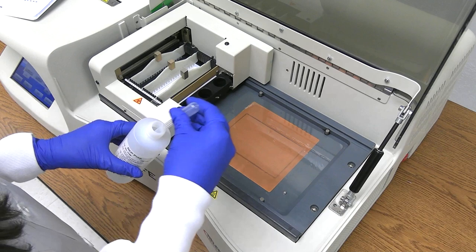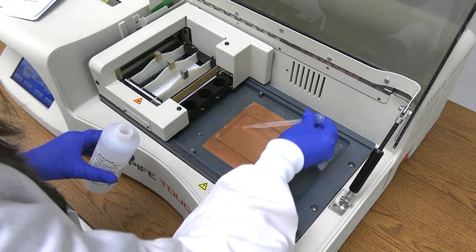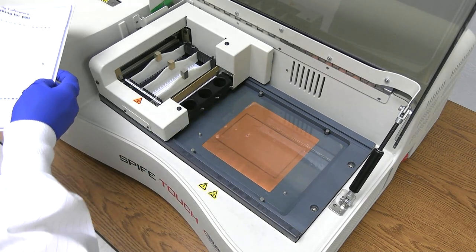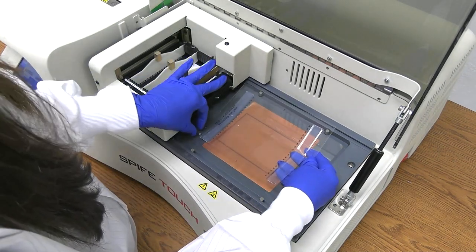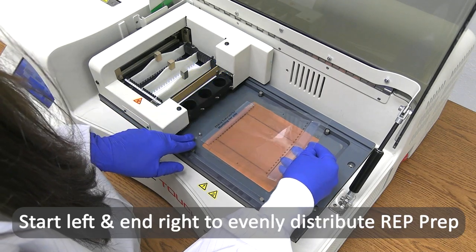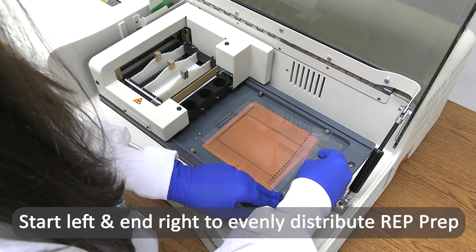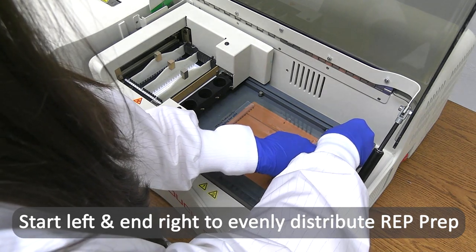Dispense approximately 2 milliliters of prep on the left side of the electrophoresis chamber. Place the left edge of the gel over the prep, aligning the round hole on the left pin of the chamber. Gently lay the gel down on the prep, starting from the left and ending on the right side, fitting the round hole over the right pin.